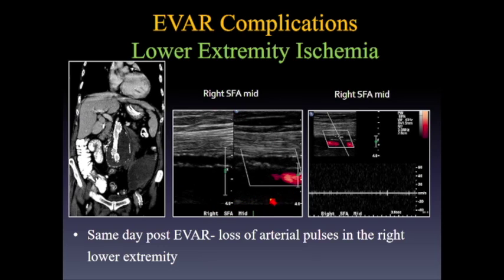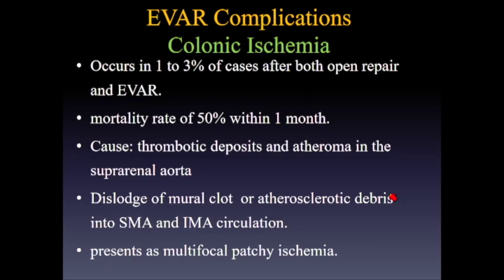So we did a Doppler ultrasound of the right lower extremity, and that demonstrated no flow within the SFA, as well as no spectral Doppler waveforms. So it was an occluded SFA and needed anticoagulation.